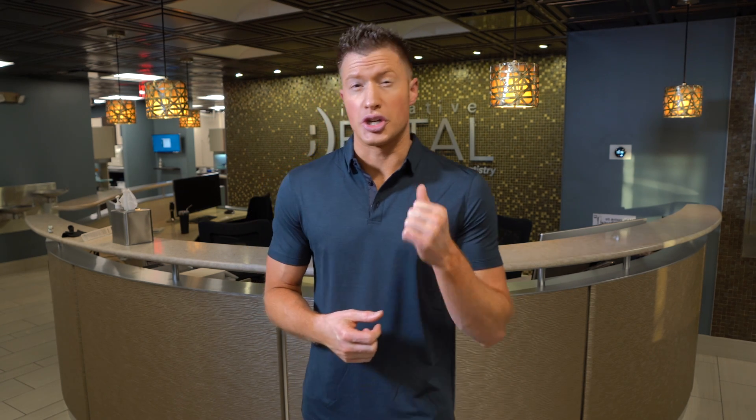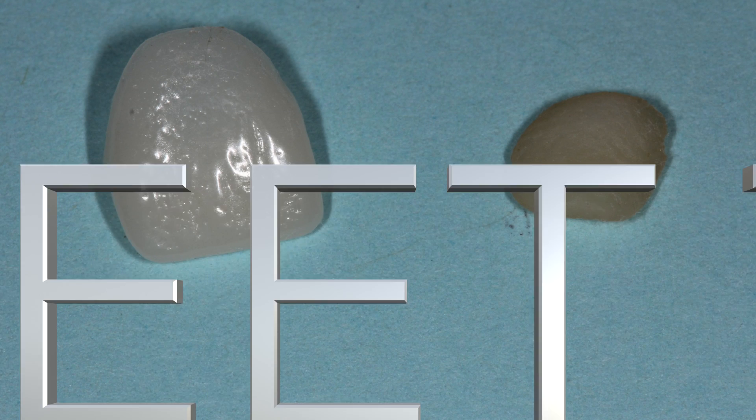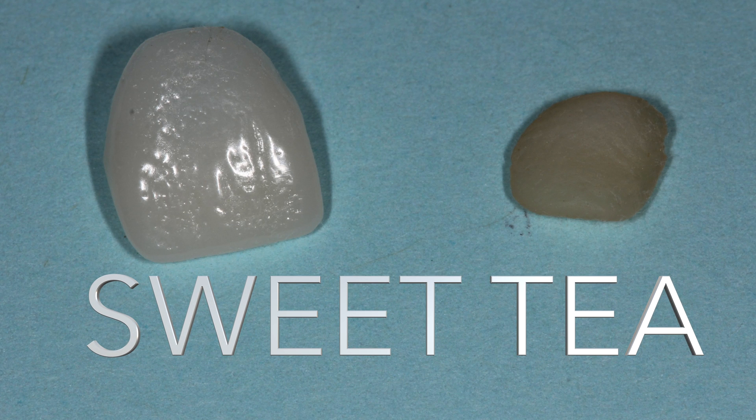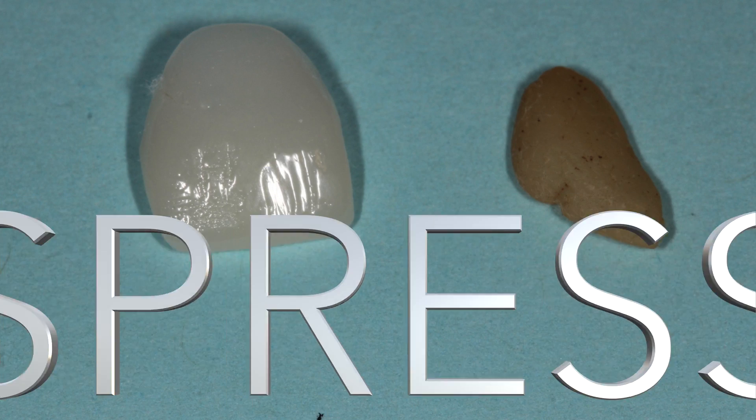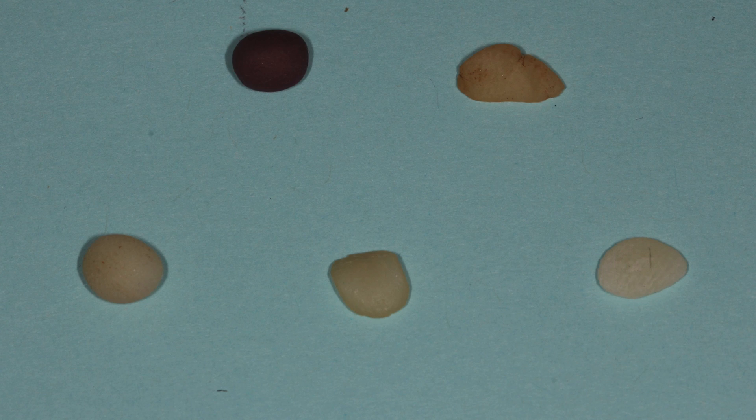The next one was the Coke — a little bit of stain on the composite, not nearly as bad, but nothing on the porcelain veneer. And the third one was the sweet tea — golly, love sweet tea — sweet tea stained the composite a little bit, didn't stain the veneer at all. The all-porcelain veneer is still holding up. All you Starbucks lovers out there — how does espresso do? Pretty bad. Espresso stained the composite tooth-colored filling really badly, but didn't change the veneer at all. So that's four for four — all of those stains for seven days, 168 hours, did not stain the all-porcelain veneers at all.